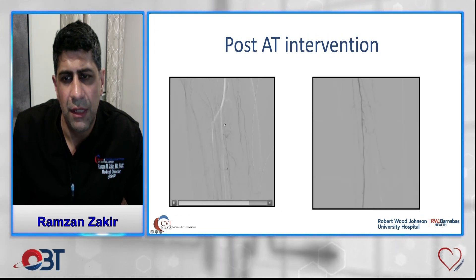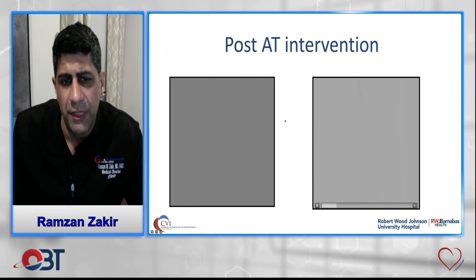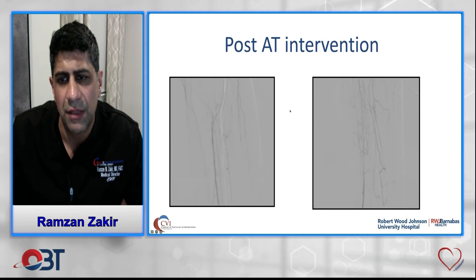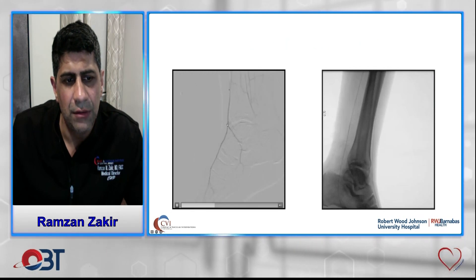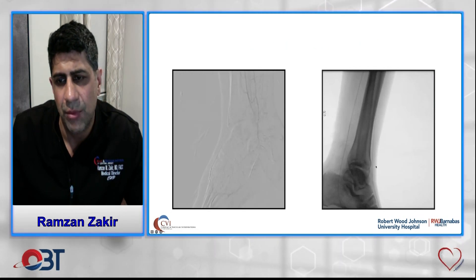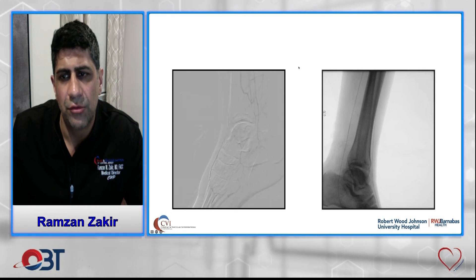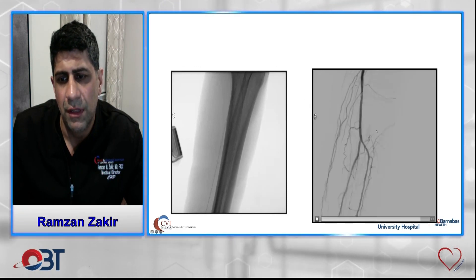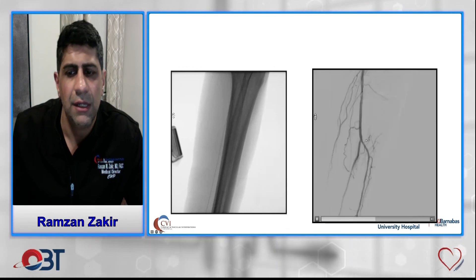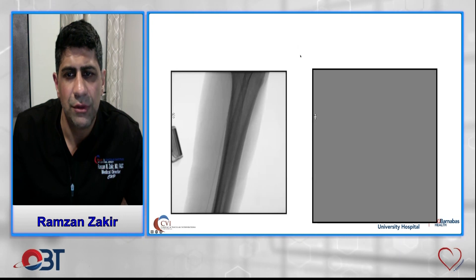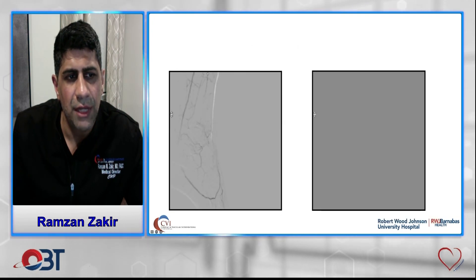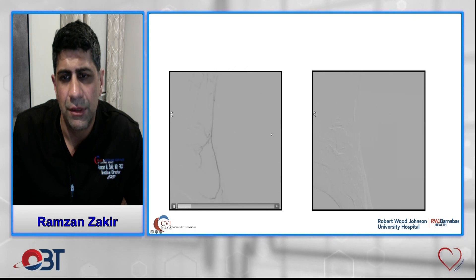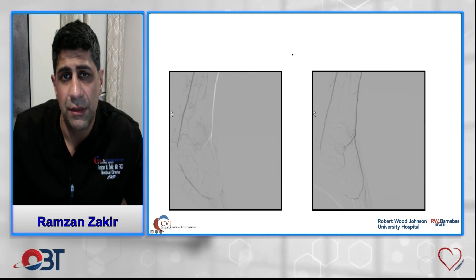After anterior tibial artery atherectomy and angioplasty, we used the pedal arch as a conduit to revascularize the posterior tibial artery. We traversed down the anterior tibial artery, across the arch, and worked the wire all the way back up to true lumen in the popliteal artery. After externalizing the wire, we performed laser atherectomy, angioplasty, and placed one stent in the posterior tibial artery. The final result shows a patent anterior tibial artery, patent posterior tibial artery, and a complete plantar arch — allowing the patient to heal both his heel and toe ulcers.